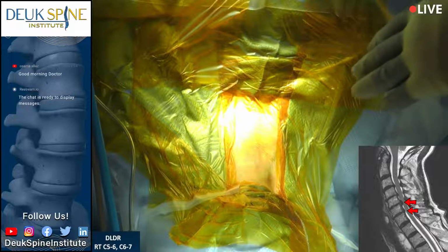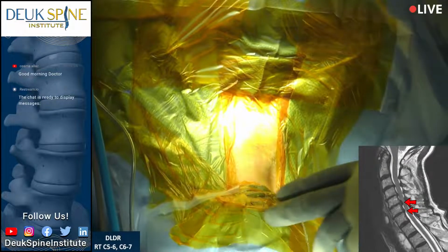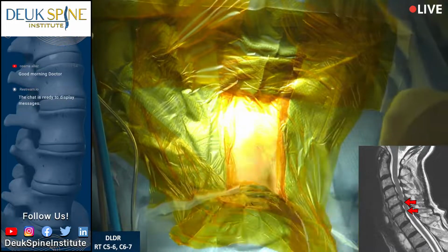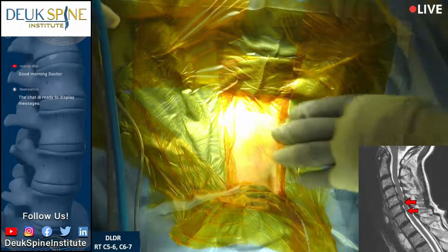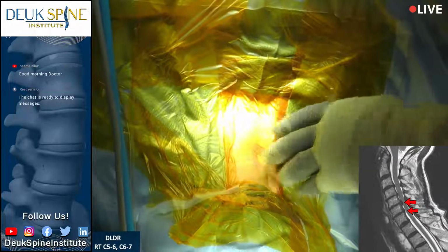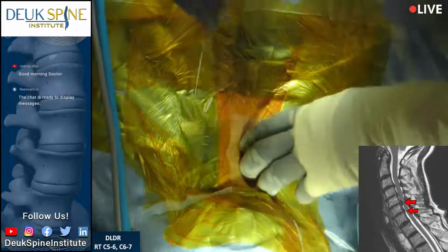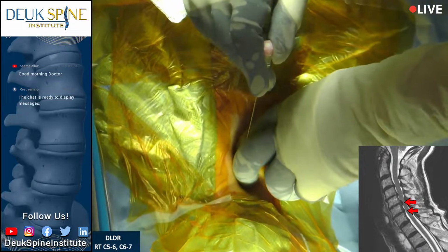Now we're doing a right side of the neck approach. If you look at this here, can you see the patient? Her face is covered. She has a tube in her throat. It's called an endotracheal tube. It goes down and it's ventilating her lungs. And this is the front of the neck on the right side. And this is where we're going to go in. Okay? So, without further ado, shot.